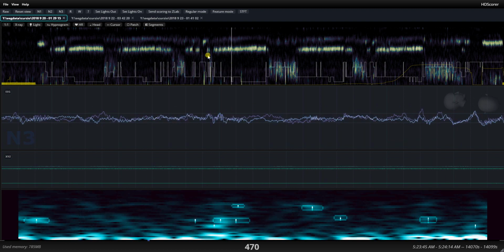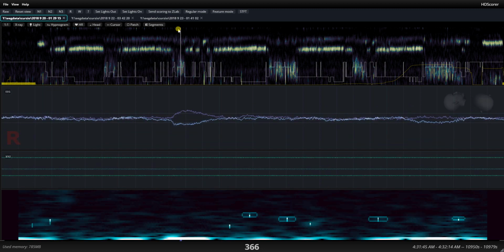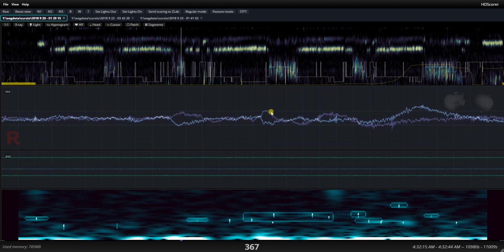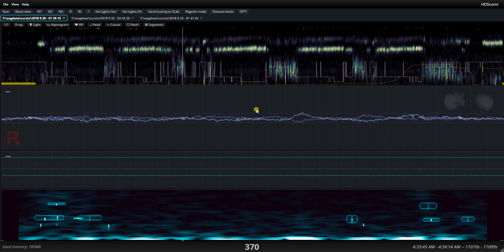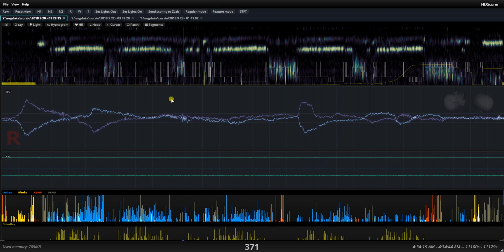One thing that interests me is to go and see this REM period right here, see if I can find evidence of eye movements, which I can find a little bit here and here as well. Good thing that they got caught because they're very mild, and here definite evidence. And now when the eye movements are really, really strong, you should see them in orange in this wave right here.